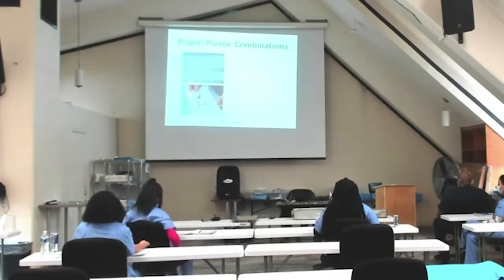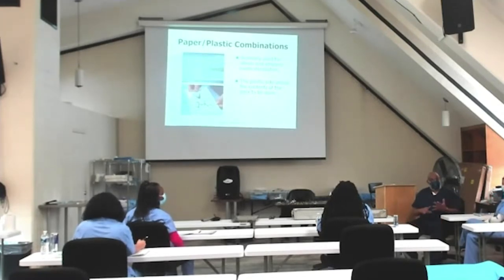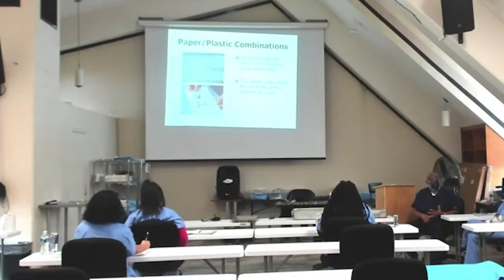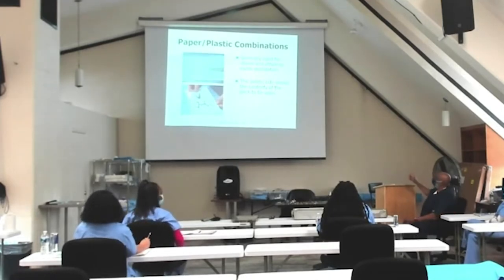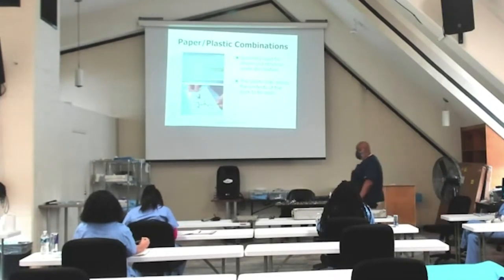Now, when we're looking at paper to plastic, this is for you people over in sterilization. You're my steam team. Don't forget, you guys are putting in wrap trays, you're putting in rigid containers. You also are doing single instruments, okay? So you have to make sure that you're loading them properly and the correct method is paper to plastic. What do you mean, Mr. Ford? Okay, I'm glad you asked.